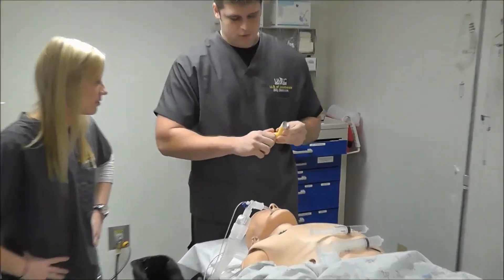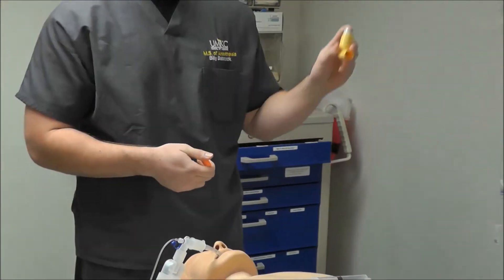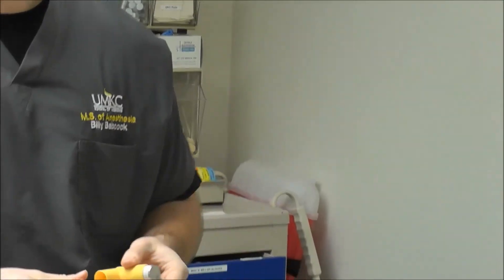The first thing I want to show is just how a normal Albuterol inhaler works. You just go ahead and squeeze it and you can see it comes out.